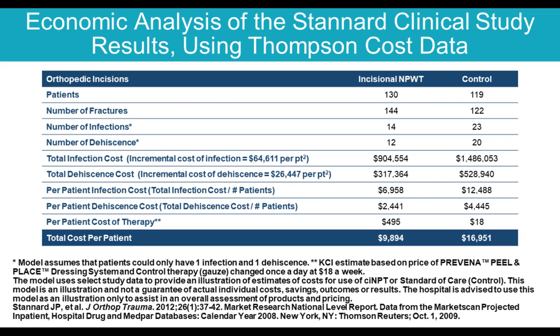This is an interesting analysis of their data, and the purpose of this post hoc analysis was to look at cost, which is on all of our minds in today's healthcare system. And this kind of cost analysis is helpful at understanding the cost effectiveness of this kind of intervention. We know incisional negative pressure therapy is not inexpensive, especially when compared to gauze.